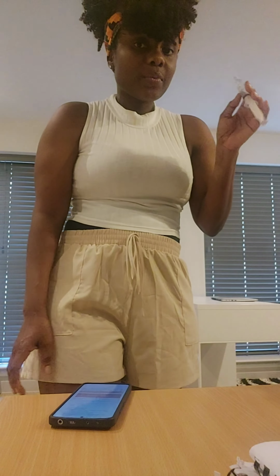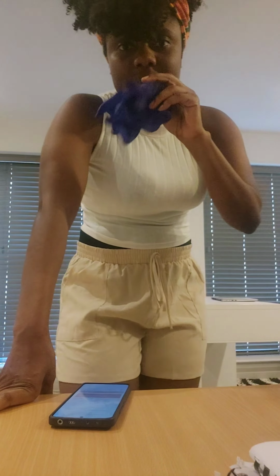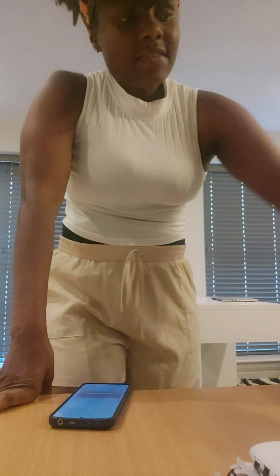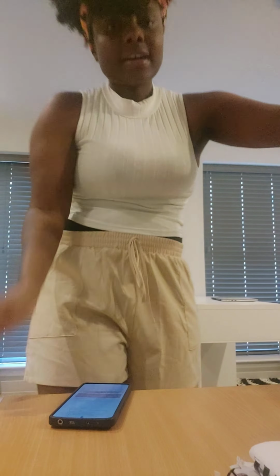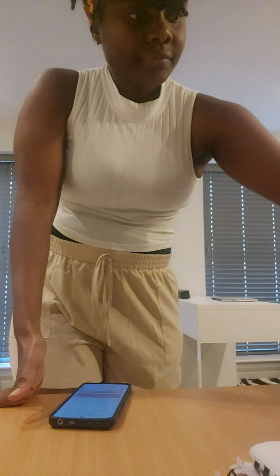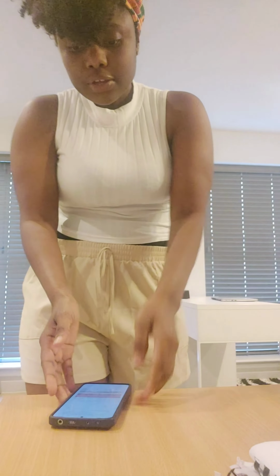Examiner, can you confirm whether it's in date? In date. Alright, so I have my examination gloves here, which are clean and intact. I have my alcohol wipe, which is clean, intact, not exposed. Expiry date is February 2026. I have my apron here. My equipment is safe and sterile, so I'm happy to use it.